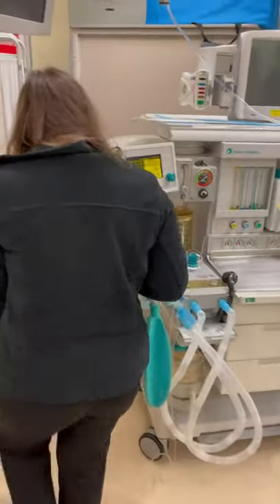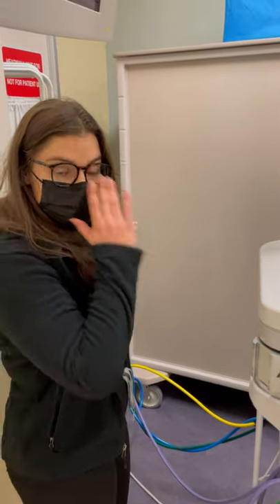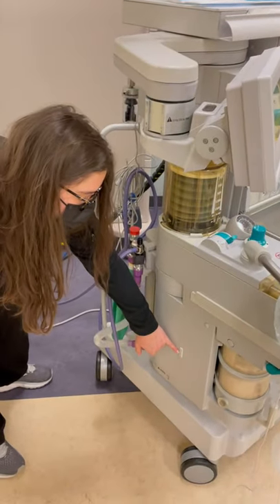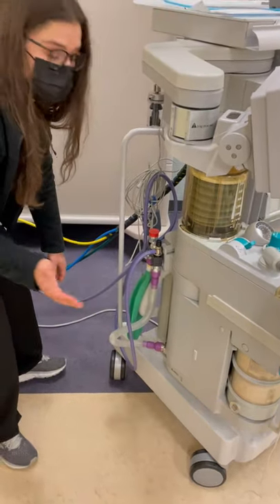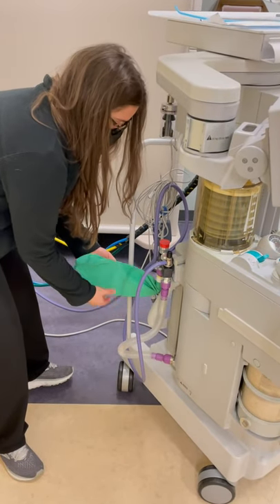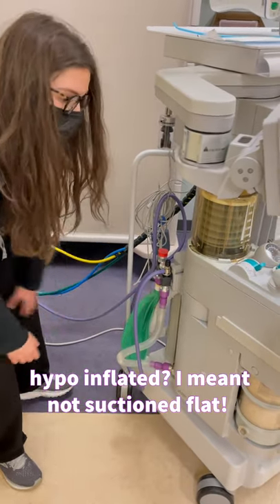During calibration, I'm going to go back to my scavenging system. This purple is my vacuum — I checked when I was checking the diameter index safety system that it was on. On some machines you'll have a meter right here, and if the ball is floating between the two marks, your vacuum is appropriately suctioning, not too high or too low. I'm also looking at the scavenging bag for any obvious holes and to make sure it's not hyperinflated or hypoinflated. It looks pretty good — no cracks or kinks.